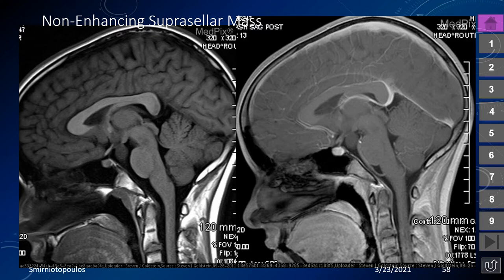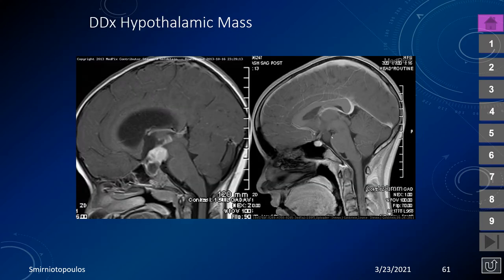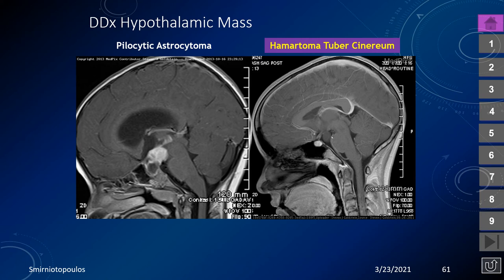This is a non-enhancing suprasellar mass located in the suprasellar cistern between the chiasm and mammillary bodies — the perfect location for a hamartoma of the tuber cinereum. On axial images, there is a rounded soft tissue mass without enhancement. Comparing side by side, the pilocytic astrocytoma shows contrast enhancement while the hamartoma of the tuber cinereum does not — an important way to make the differential diagnosis.